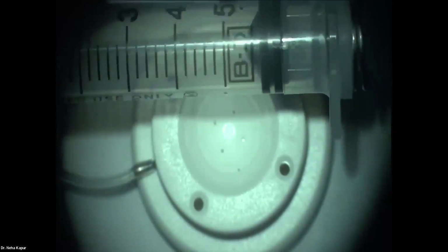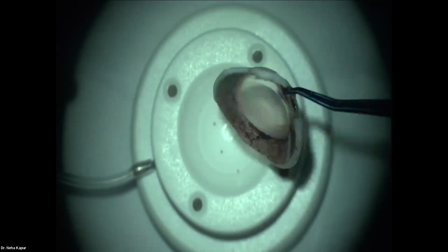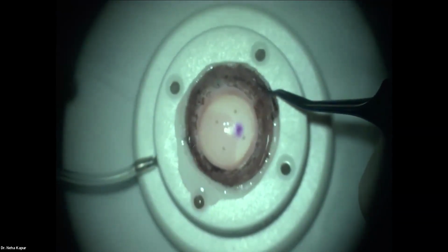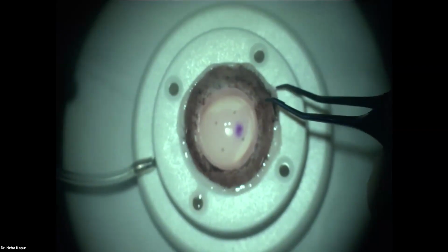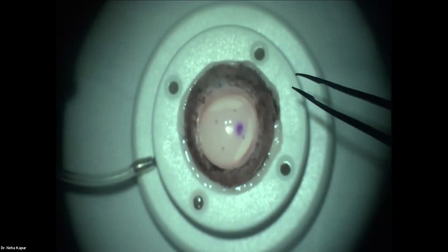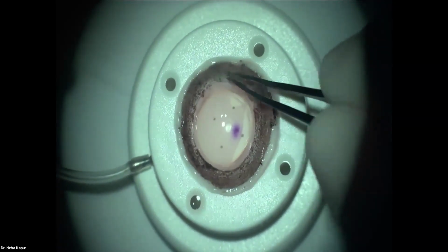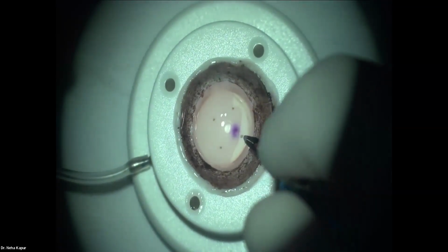And this is the suction trephine tubing that comes in. We have to keep it fully pressed before we put the tissue on the trephine, on the Teflon base. It's fully pressed because right now the suction is not built. It's important for us to center the tissue first, and only after we are centered, we tell the assistant to let go of the suction and build it.